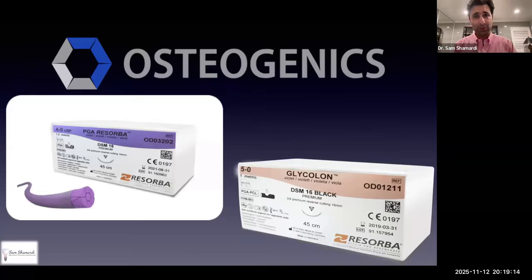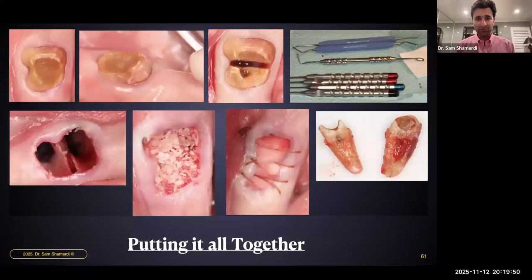You are, of course, going to have to bring your patient back in a couple of weeks, not only to check on them, hopefully, but to remove those sutures as well. But unlike a chromic gut, which usually by around 1 week's time is going to be resorbed away, if you have a more involved and bigger infection site that you are healing, or let's say you have multiple teeth side by side that you're extracting and you want to make sure that you have much better closure for a longer period of time, these two materials will hold and have very good tensile strength and give you really good results. So I wanted to show you guys two quick examples of those.